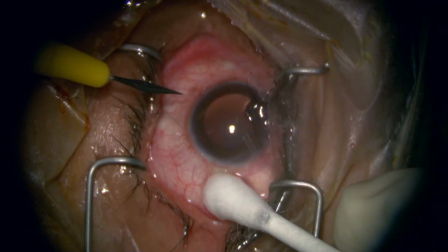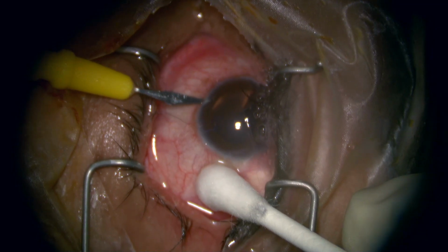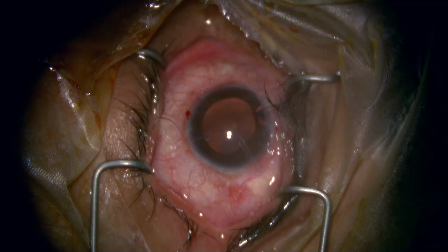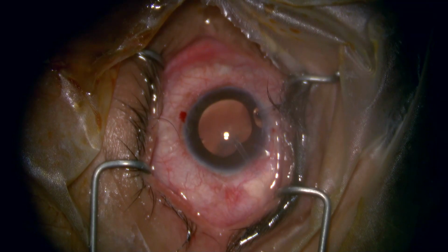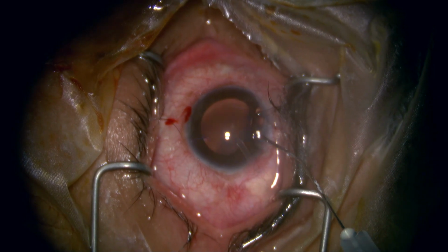Now we have to carefully choose the site of the side ports away from the AGV and also a little bit anterior to the bleb so that it does not disturb the bleb, and preferably the main incision should be away from the tube, and mostly the open space where we get the main port is the temporal side.